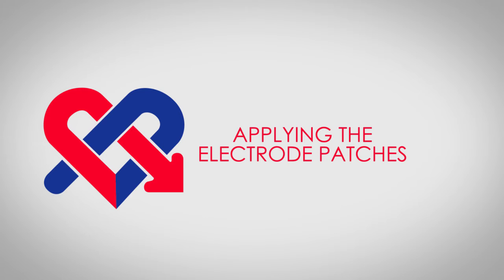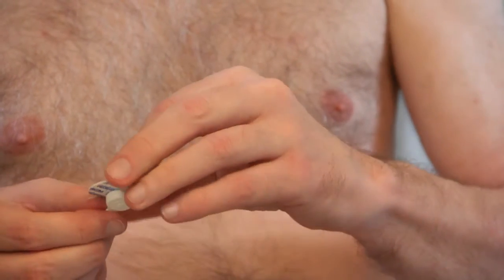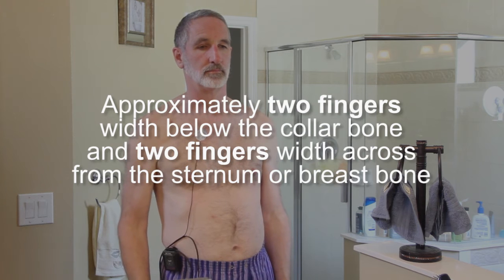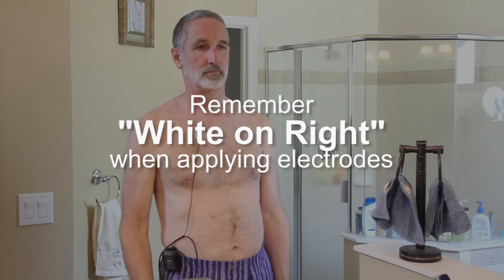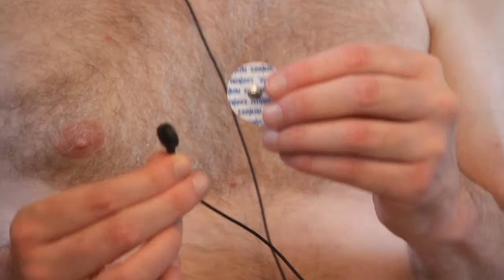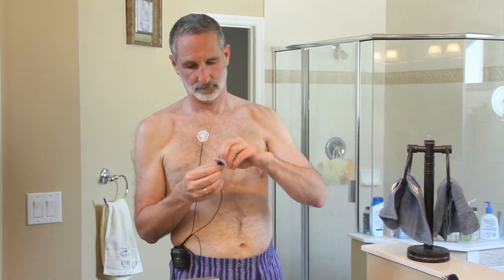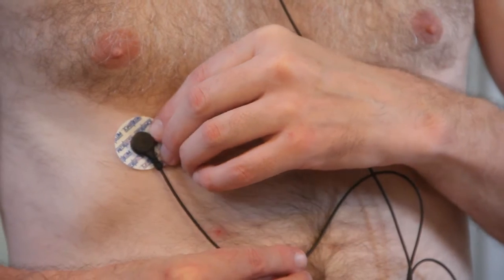Applying the electrode patches: Find the patient cable. First, take the wire with the white terminal and snap it onto one of the electrode patches. Peel it from the plastic backing and apply it to the upper right area of your chest, approximately two fingers width below the collar bone and two fingers width from the sternum or breast bone. Remember: white on right when applying electrodes. Now take the wire with the black terminal, snap it onto one of the electrode patches, peel it from the plastic backing, and apply it to the lower right below the white one. It should be applied over the first rib you feel below the breast in a direct line down from the midpoint of the collar bone.